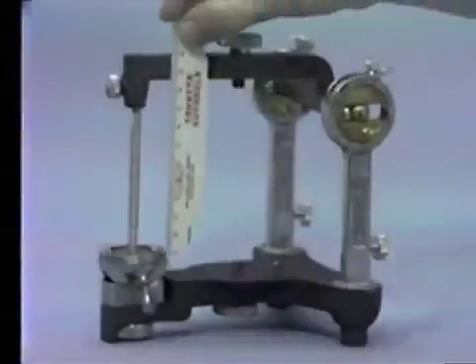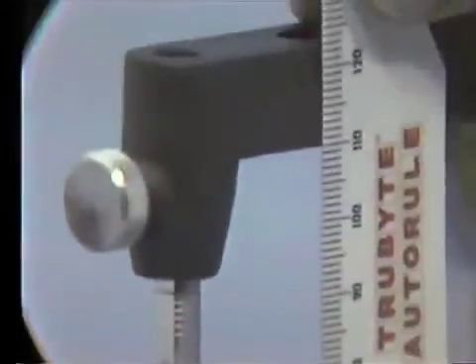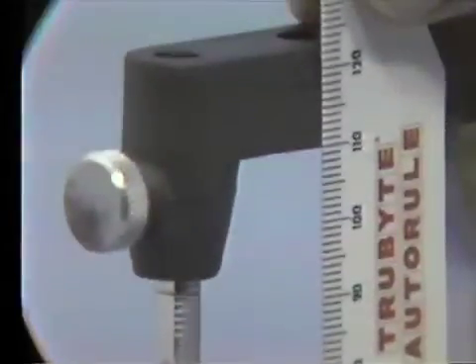The distance between the upper and lower members of the articulator should be about 110 millimeters when measured just behind the incisal table with the pin correctly positioned.